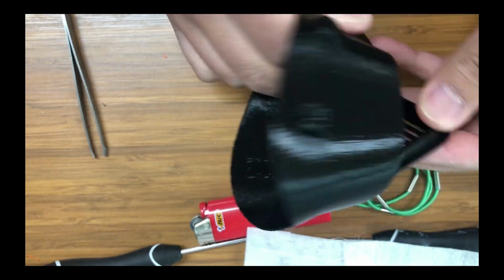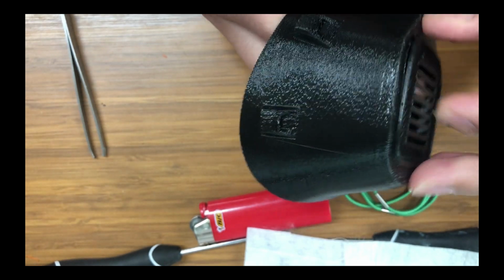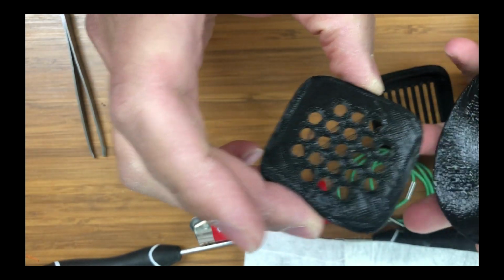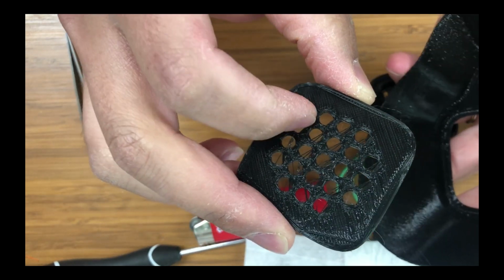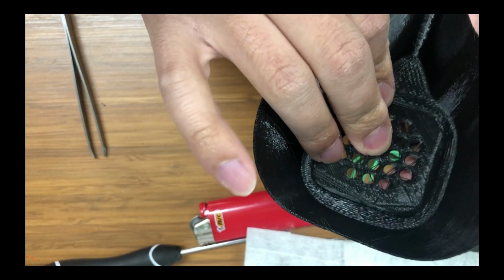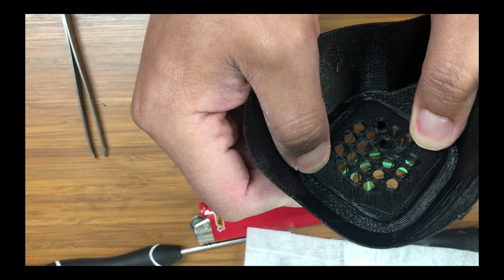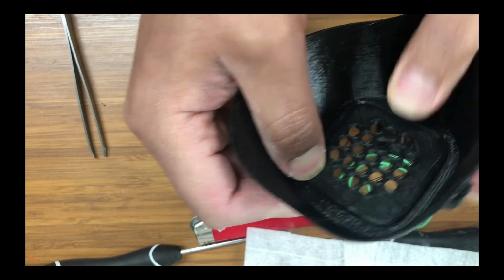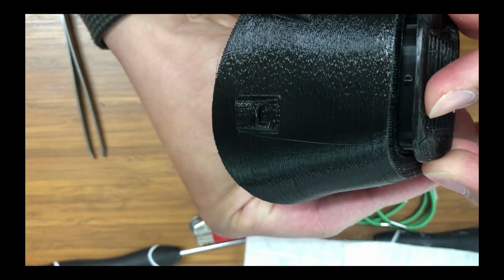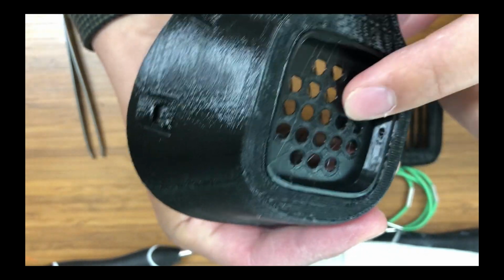So what you want to do, this one's a little bit loose, the one with the horizontal grill. It's a little bit loose when you put it on. So what you want to do is get this one right here, the one that looks like it has holes in it, and put this in there. But I made a mistake the first time when I did it. I was trying to push this in really, really hard, but you don't have to push this in all the way hard like that. It's going to basically snap together on both pieces when you assemble them. Okay, so we got this right here already.